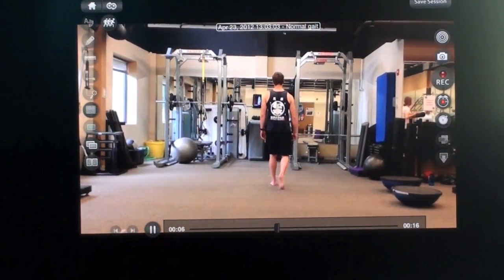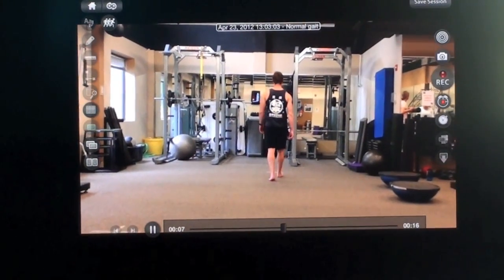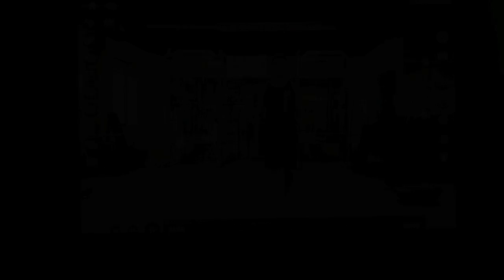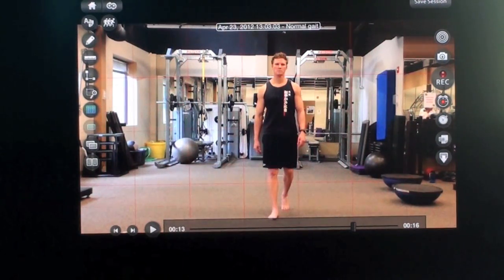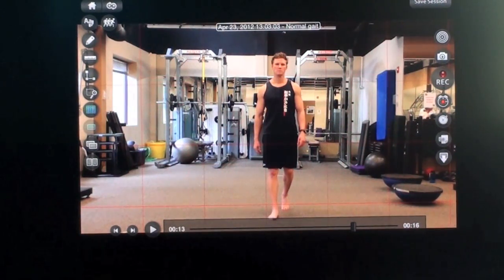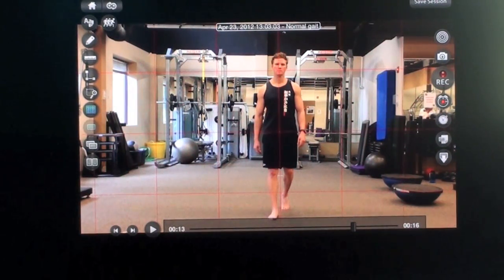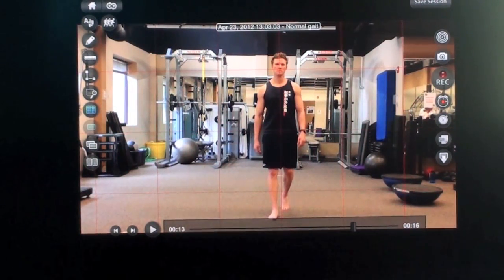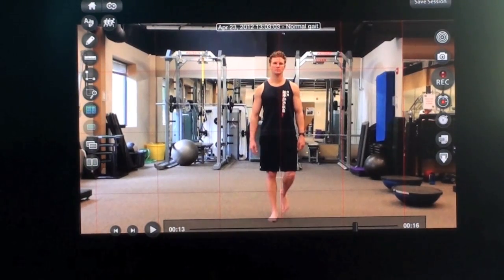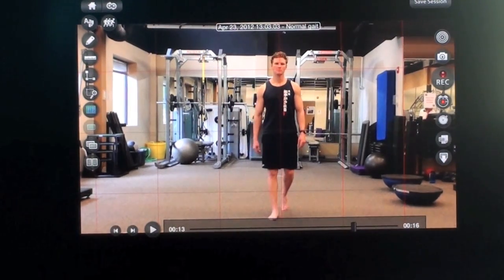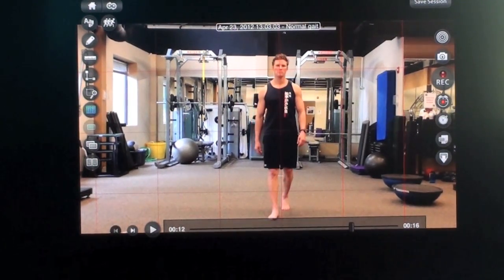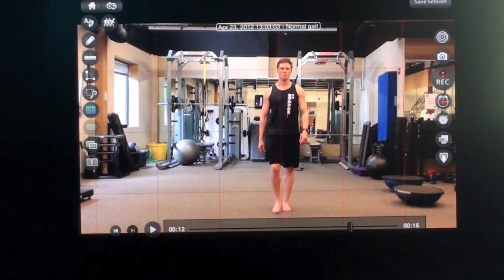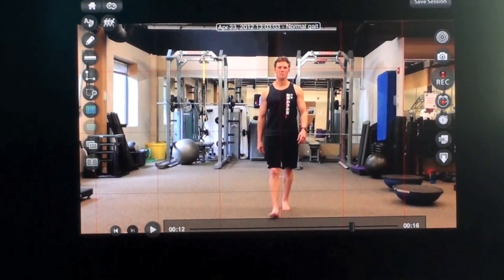Say you want to look at the left foot — front stride in gait — what's exactly happening? You can also use tools like the Posture Grid to look for drift. Put a center line on the body. Are they drifting one way or the other? Does the foot cross the midline on one side more so than the other? Again, this is just information that you are gathering.